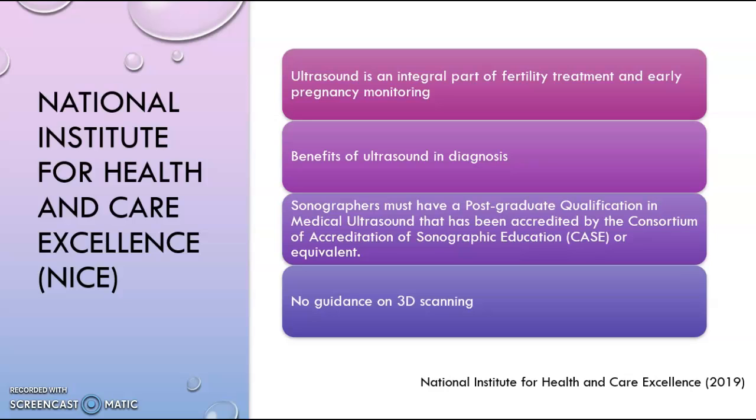Throughout the guidance, NICE state that ultrasound scans need to be performed and monitored by a trained individual with a postgraduate qualification in medical ultrasound that has been accredited by the Consortium for the Accreditation of Sonographic Education, CASE. This is echoed by the RCN, BMUS, and the RCR. However, it is not discussed whether 2D or 3D ultrasound offers better diagnosis, despite studies, such as Gregor and Mayer, supporting the use of 3D ultrasound scanning as a gold standard in care.